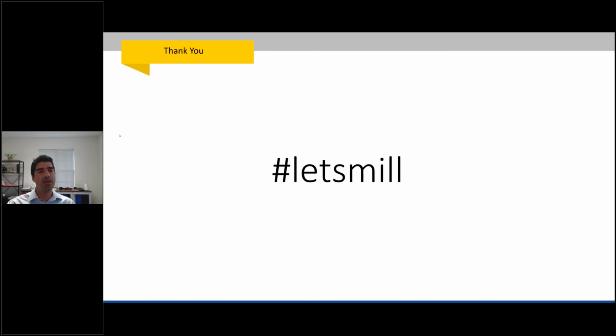On our website, there's a link directly to the release notes. So if you Google Millbox release notes, that'll get you really direct there, or you can go to our website. You can type in CIMSystem.com and go there. We have a dental and a manufacturing side, so you need to go into dental. You can also go straight to millbox.com, which leads you ultimately to the same place.